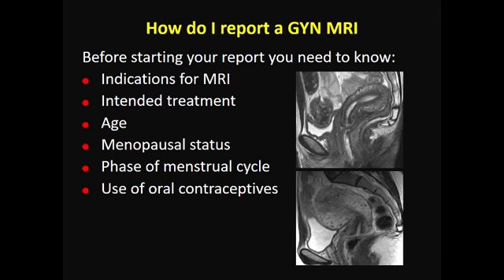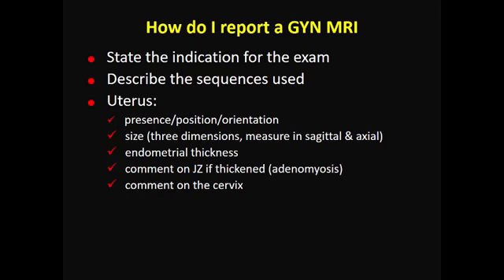State the indication for the exam and describe the sequences used. In our hospital this actually comes automatically, so we don't need to do that. You have to adapt it if you gave antiperistaltic agents or not, just to make sure you're accurate.